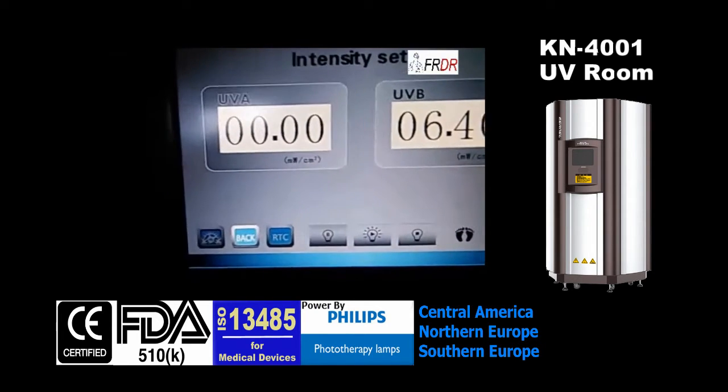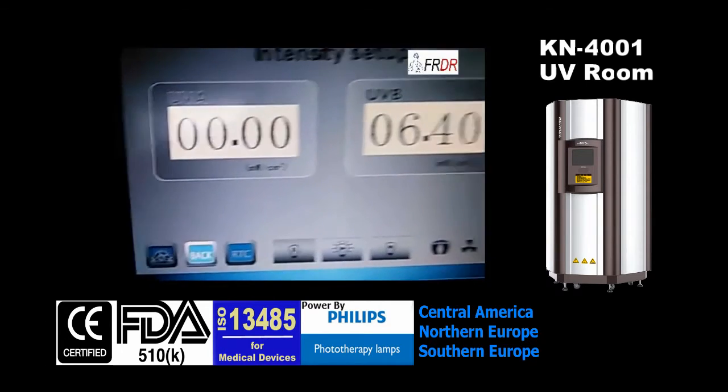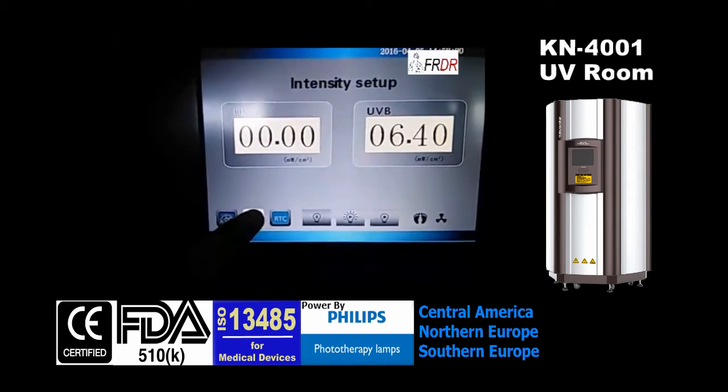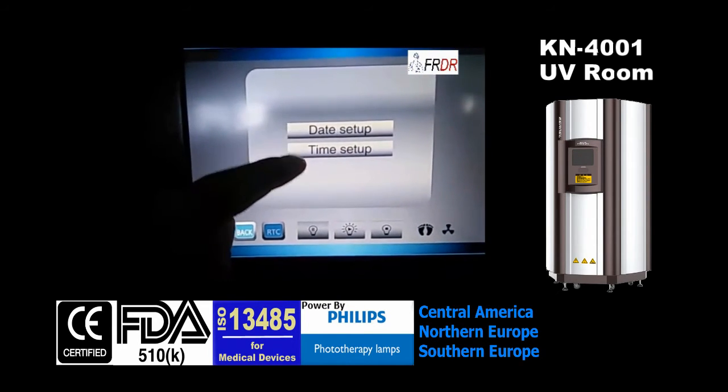This mode is to change the intensity of the lamp. This is to change the date and time.